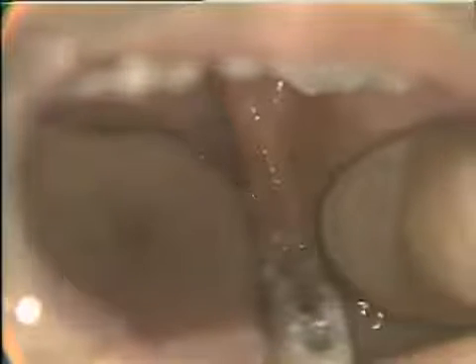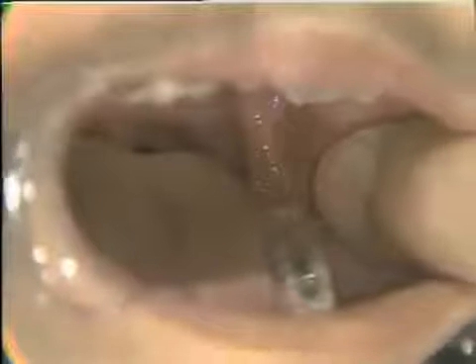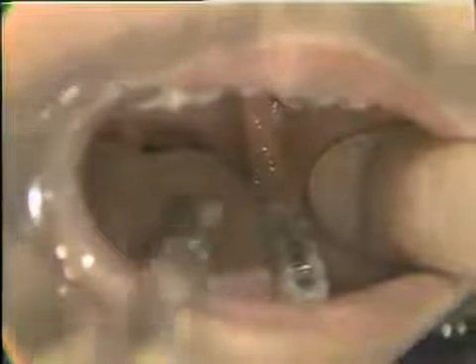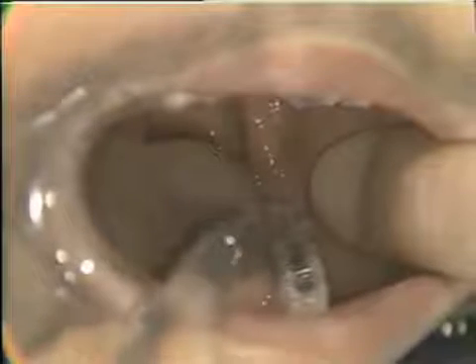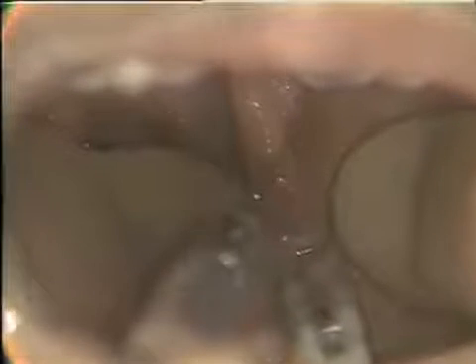Now we'll apply a little tincture of betadine to our injection site. We have that accomplished, and now we'll go to our injection. I know where the internal oblique line is, and our initial puncture will be made just medial to it. The syringe is over the bicuspids on the opposite side, and we give Andy a little squeeze between our thumb and finger just to distract him a bit.